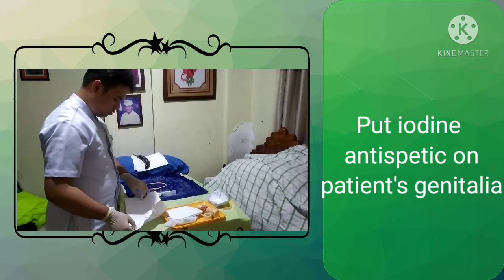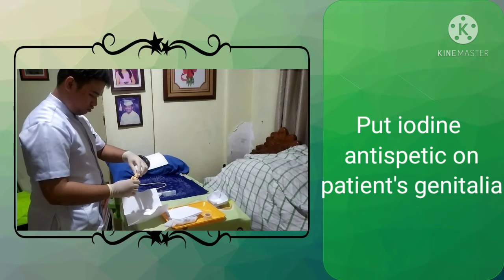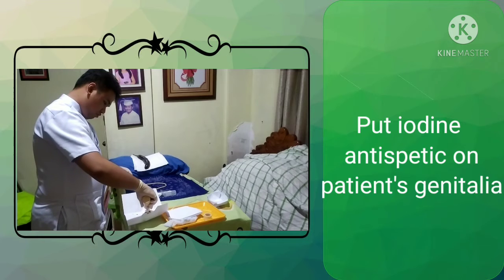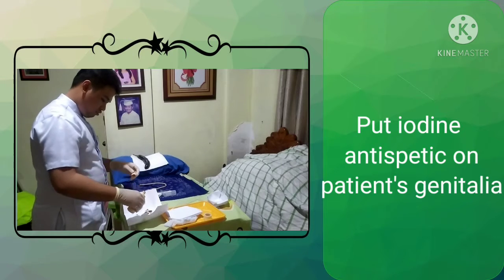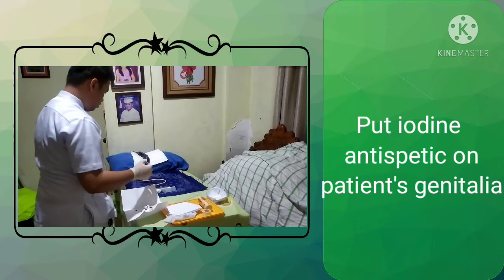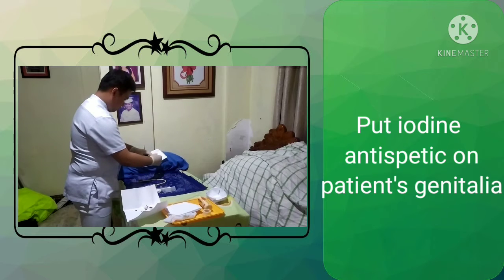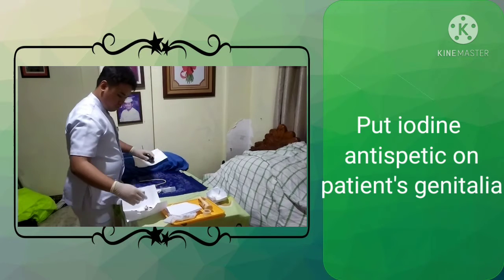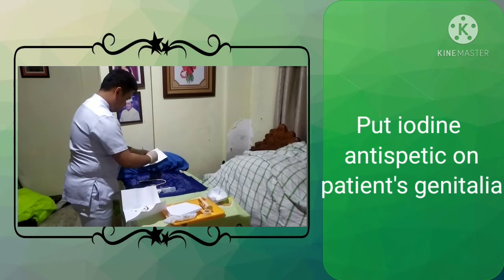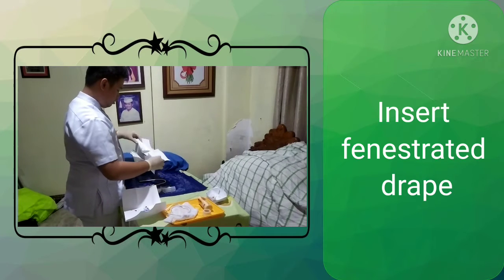Put iodine-based antiseptic on patient's genitalia. Insert fenestrated drape.